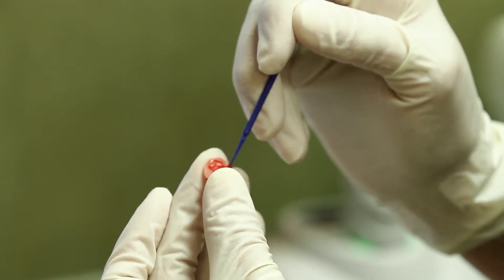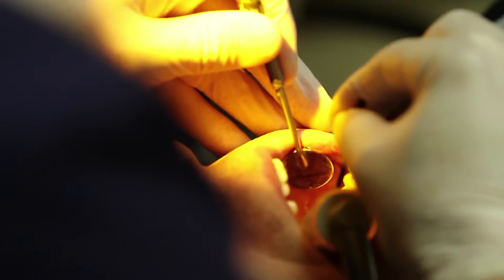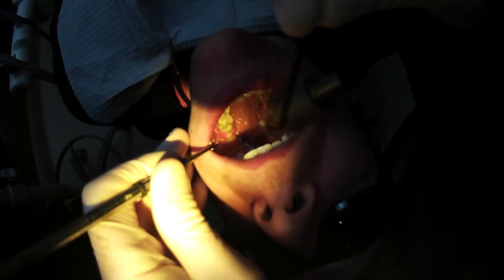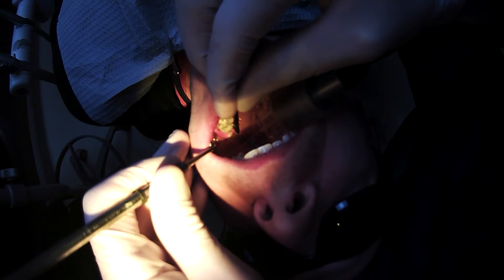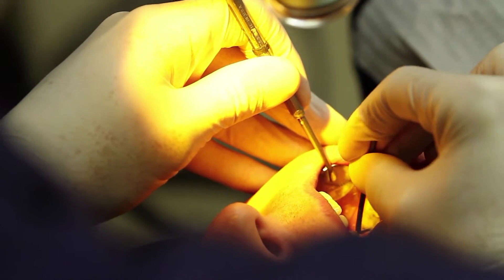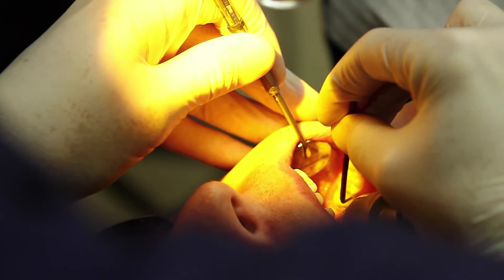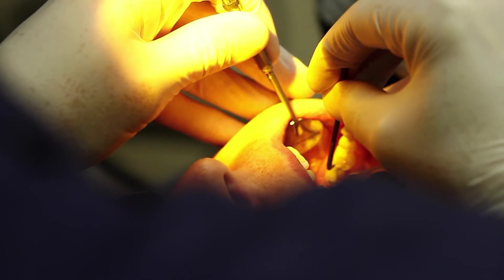We have acid etched the intaglio of the crown with hydrofluoric acid for 20 seconds — that's part two. We're now going to use part one on the tooth for 20 seconds. If you use an overhead surgical light, it would be wise to filter it because you will start curing your bonding agent ahead of time. We leave retraction cord in whenever possible — it makes cement cleanup much easier. This goes on for 15 seconds, but the dentin doesn't fully etch until you're past 15 seconds, so make sure you do it for 20 full seconds. Then air dry.